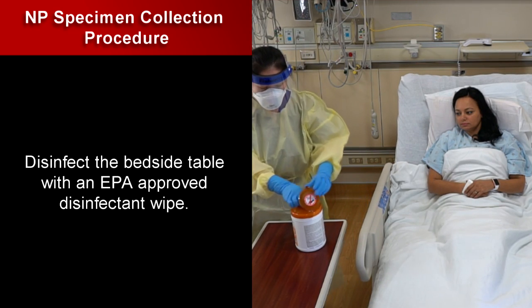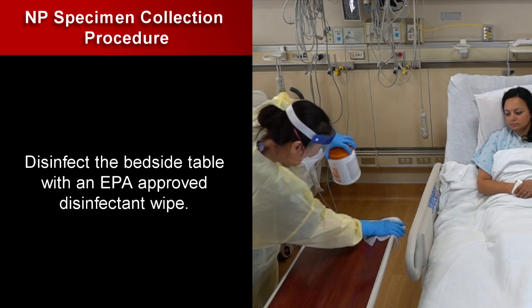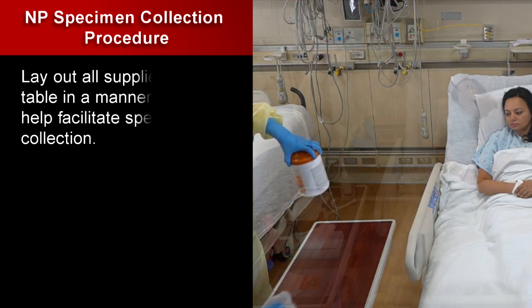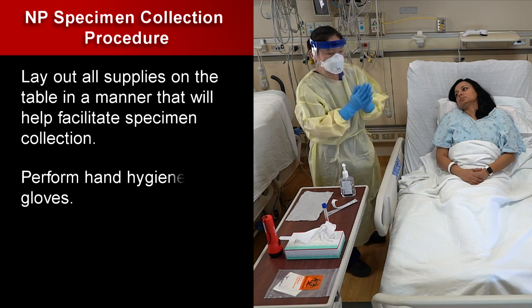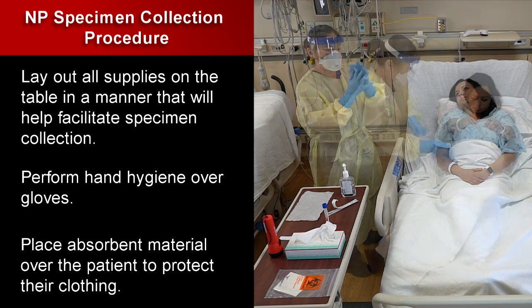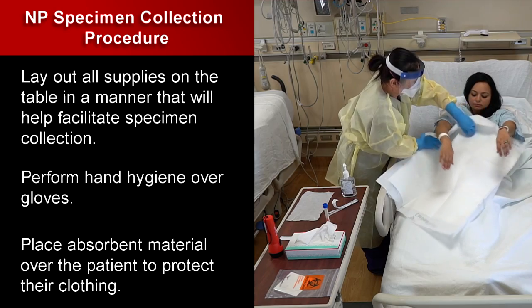Disinfect the bedside table with an EPA-approved disinfectant wipe. Lay out all supplies on the table in a manner that will help facilitate specimen collection. Perform hand hygiene over gloves. And place absorbent material over the patient to protect their clothing.